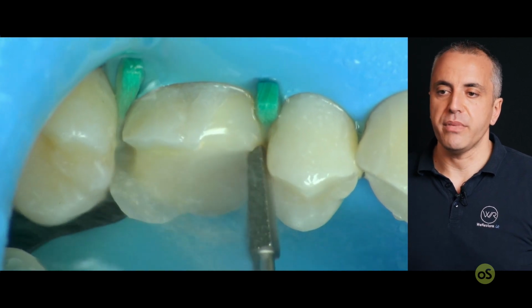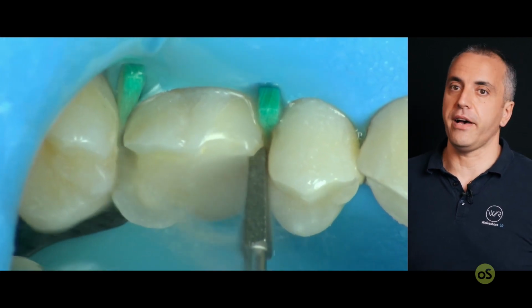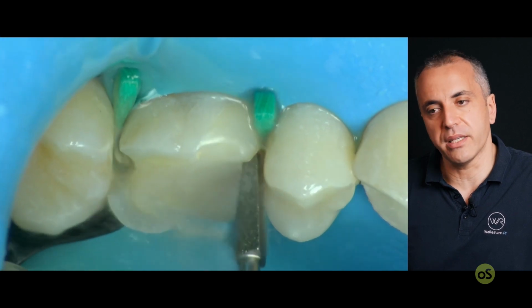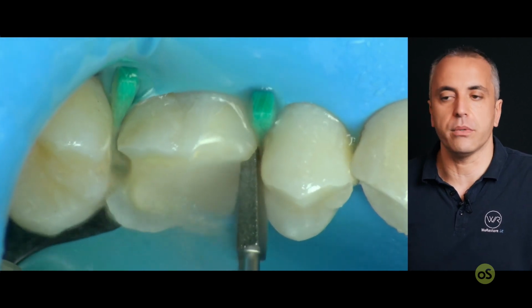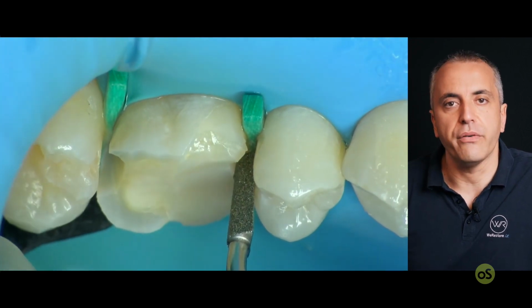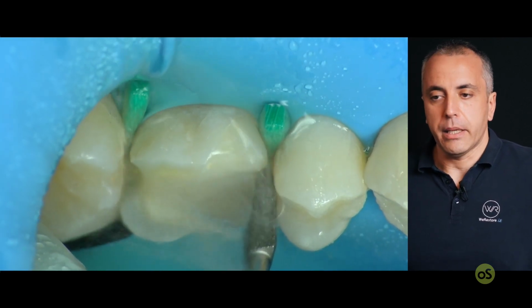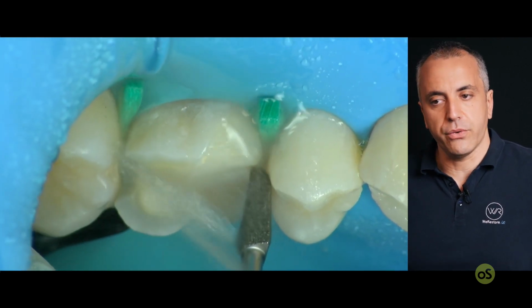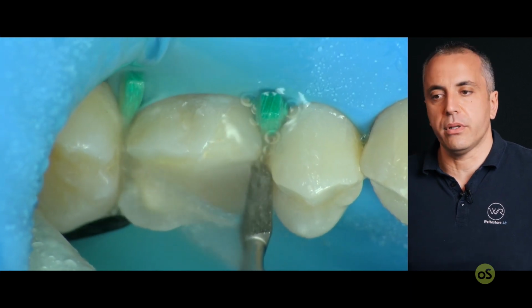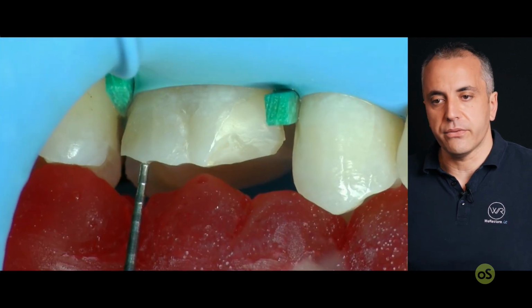Now we start to prepare mesial. Mesial is composite, mesial is built up. There is a never-ending fight against margin relocation and closing overlays on a direct restoration. I'm talking about margin relocation. Margin relocation will be the focus of another lecture here on Osteocom. By the way, if the restoration is away from the connective periodontal tissue attachment, me and Salvatore think that we are completely safe.